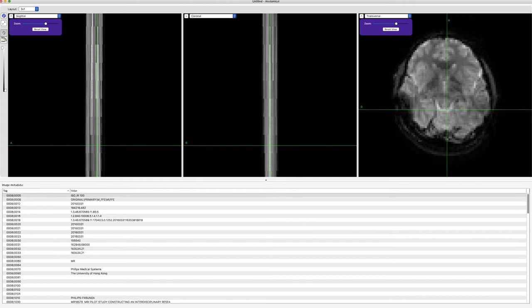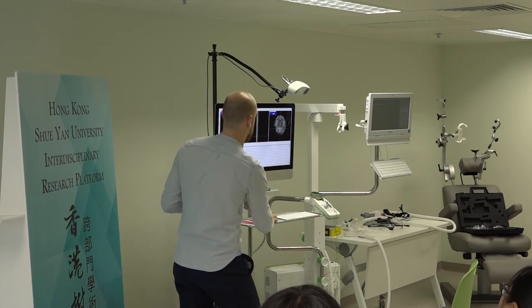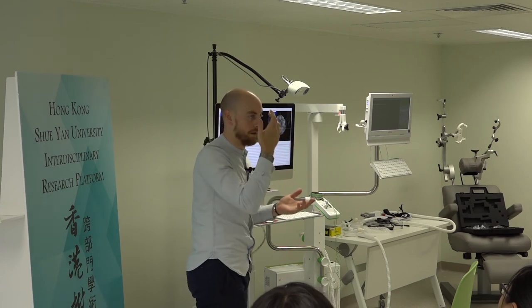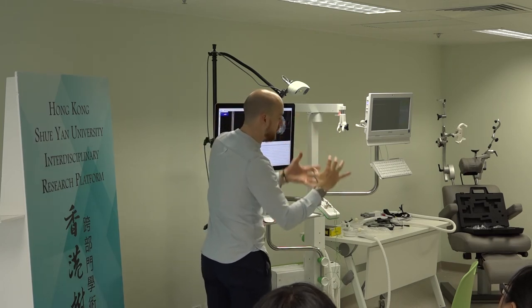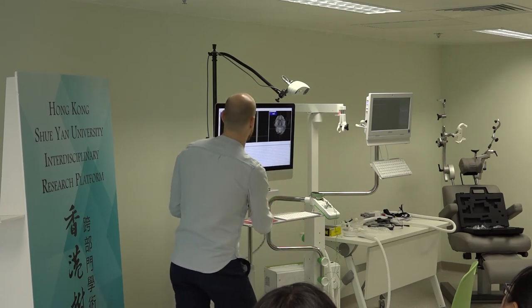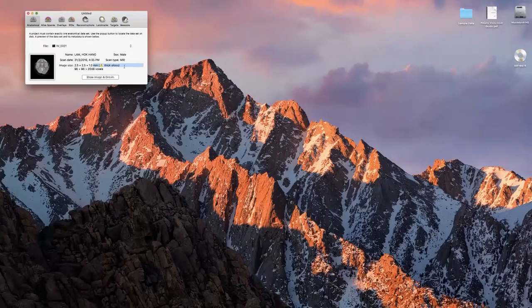We'd set them in. So then we'd orientate the size of the MRI to the size of the head by setting the atlas spaces there, so it knows we've got a distance of, let's say, 70 mil, which is way off, but let's say we've got 70 mil between the AC and the PC there. It would resize that brain electronically to the right size. But it's coming up as, so normally we'd see, so we've got an image size of 2.5 by 2.5.